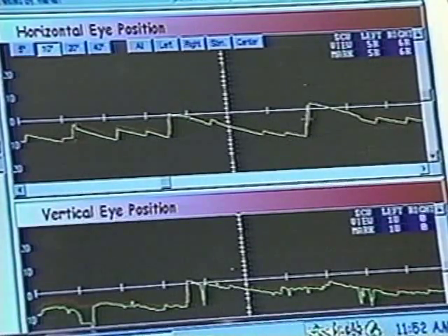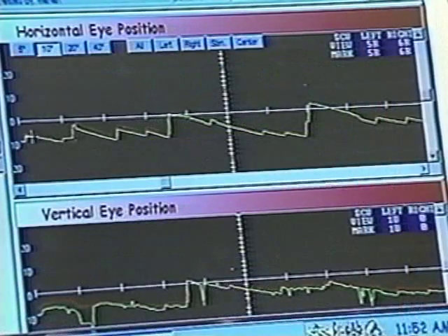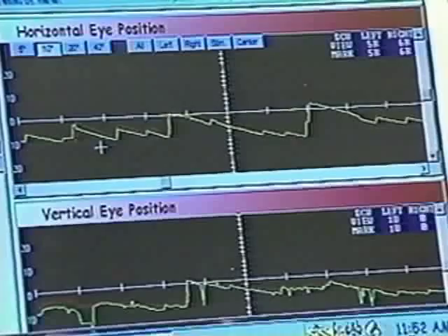In this patient, there was no response to Dix-Hallpike testing. However, an extremely brisk response, as demonstrated by 6 beats in 10 seconds to the right on the supine head right positioning. This is indicative of horizontal canal benign positional vertigo and is presented as an example of a phenomenon which occurs in only 1 to 2% of benign positional vertigo patients. However, this is an abnormal positional finding and is demonstrated for educational purposes.